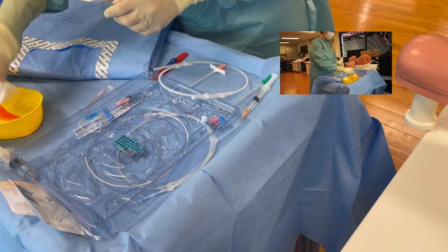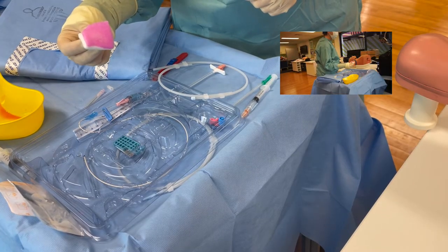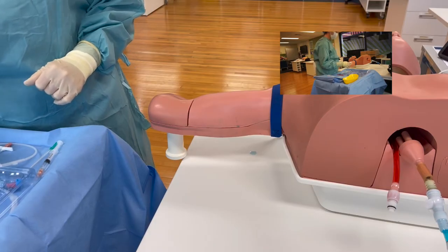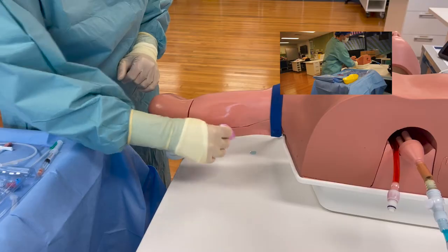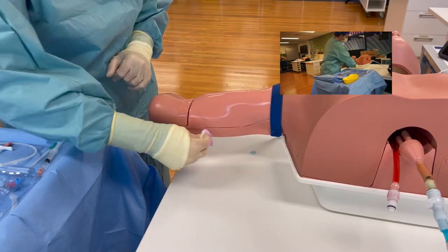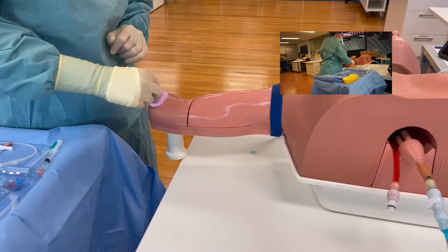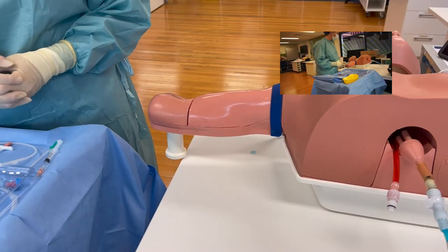You can proceed with the next step, which is some more chlorhexidine. You're going to start cleaning from your intended insertion site outwards over the whole of the upper arm. My intended vessel is the basilic vessel, so without touching the skin I am going to start cleaning in a friction movement over the intended insertion site, getting larger with increasing coverage, then all the way up and down the arm, taking care not to contaminate yourself against the tourniquet, all the way down to the end. Then discard your dirty cleaning stick or swab and allow that to dry.